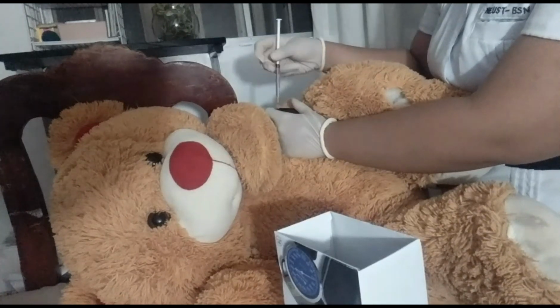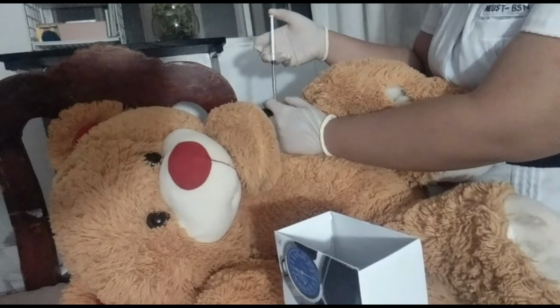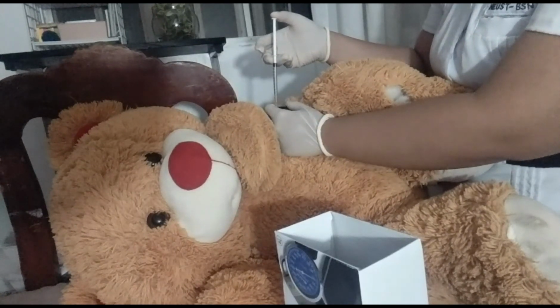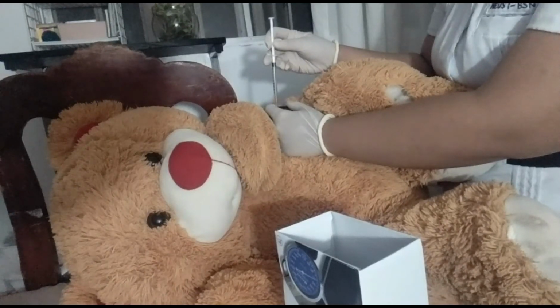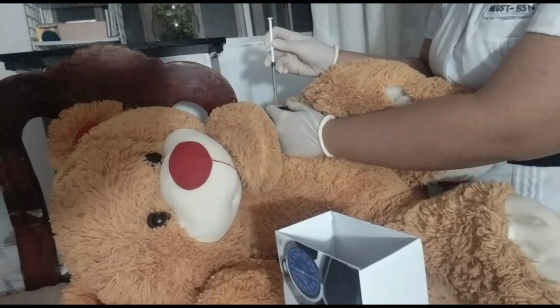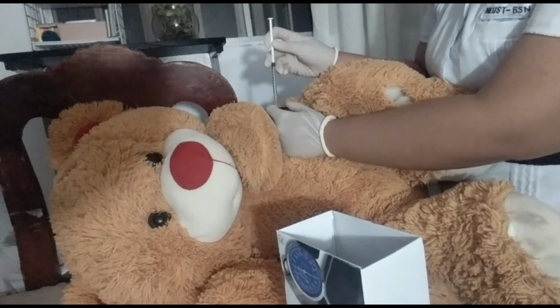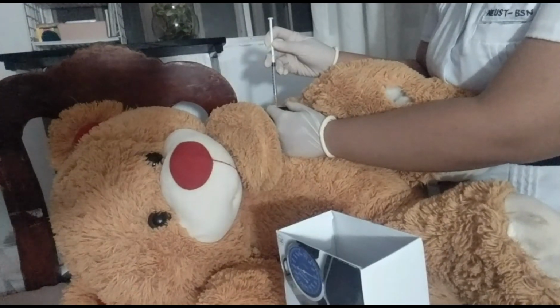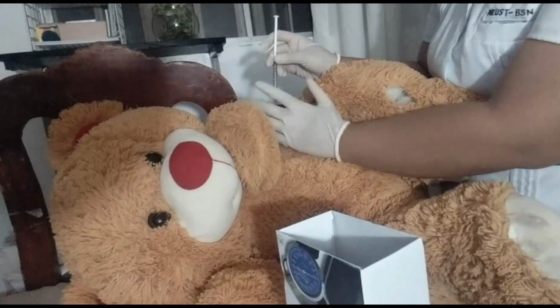Hold the barrel of the syringe steady with your non-dominant hand and aspirate by pulling back the plunger with your dominant hand. Aspirate for 5 to 10 seconds. If the needle is in a small blood vessel, it takes time for blood to appear. If blood appears in the syringe, withdraw the needle, discard the syringe, and prepare a new injection.